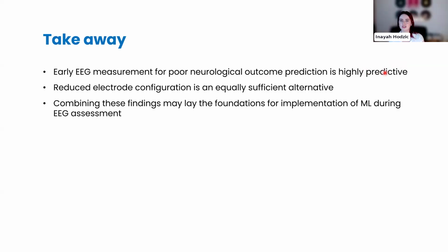And then the same question about external validation. As I said before, we didn't do external validation in this study. We have tried some external validation after the conclusion of the study. We used some public EEG challenge data and found results that are relatively comparable, but very interesting. We found that the quality of the EEG signal is very important, and that can really make a big difference in the prediction of a model like this.